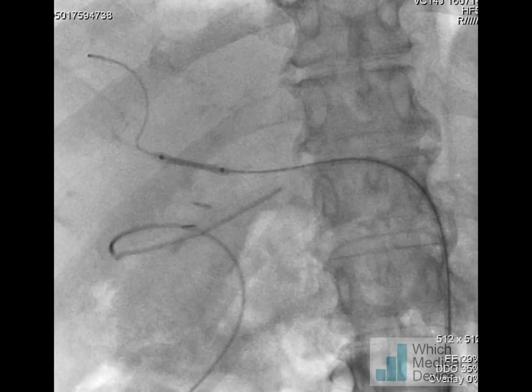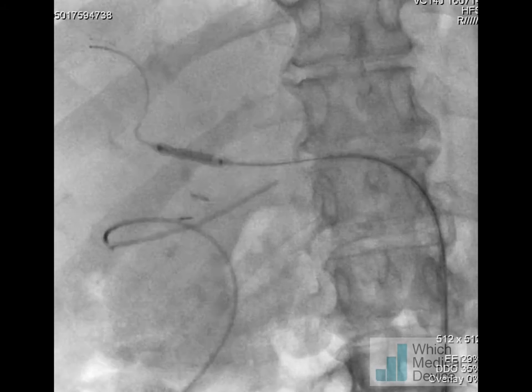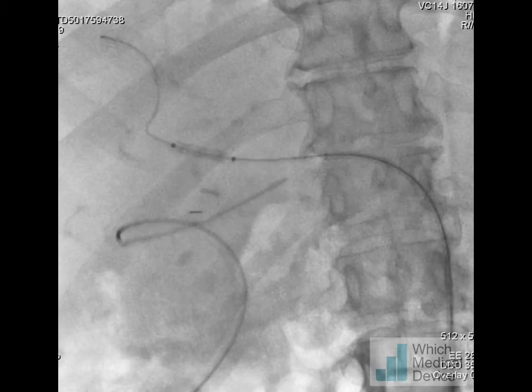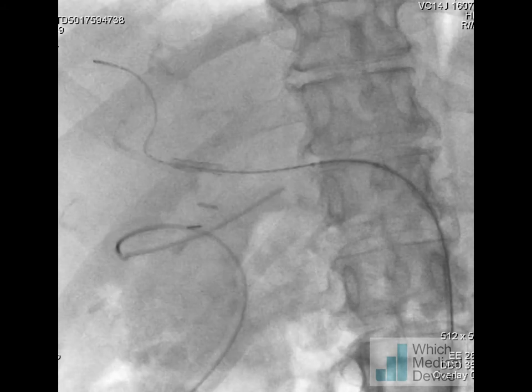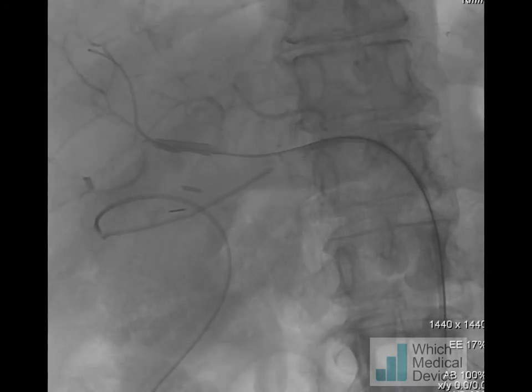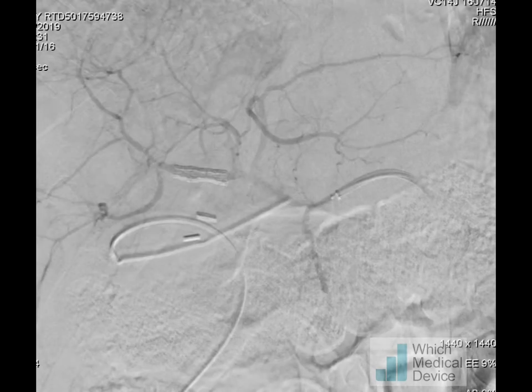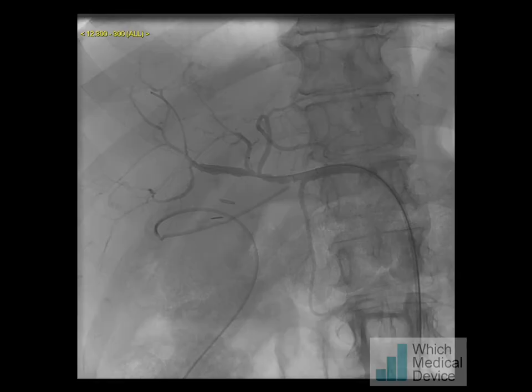The balloon is then slowly expanded using a pressure inflation handle. I'm slightly under-expanding this stent — there is some variation depending on how much pressure you put within the balloon, and I don't want to over-expand it because it's quite a small vessel. The balloon is then removed, and thankfully the stent stays in the position I've placed it. Angiography confirms that the pseudoaneurysm has been completely excluded from the circulation. There is a bit of residual spasm in some of the hepatic artery branches but no evidence of dissection, and there is excellent flow. Overall we're pleased with that result, and the patient made an uneventful recovery.